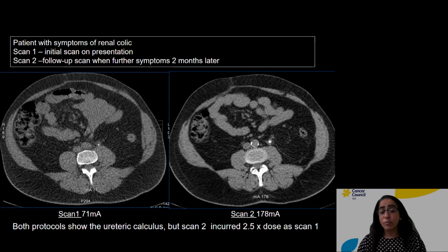This time, for some reason, a normal CT scan was done. You can see the diagnosis is the same. There's a calculus in the left ureter. The pictures are much nicer, less grainy than the other side, and you can delineate the calculus a bit more.